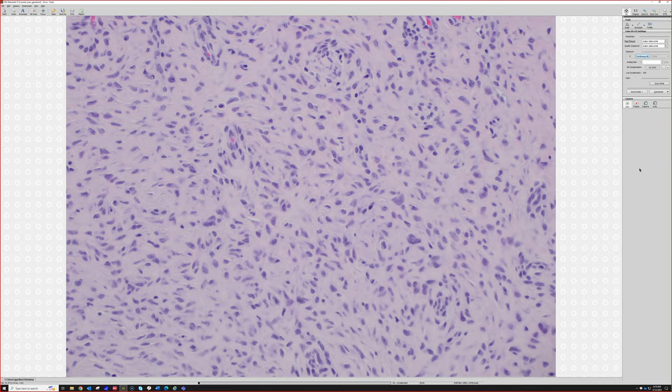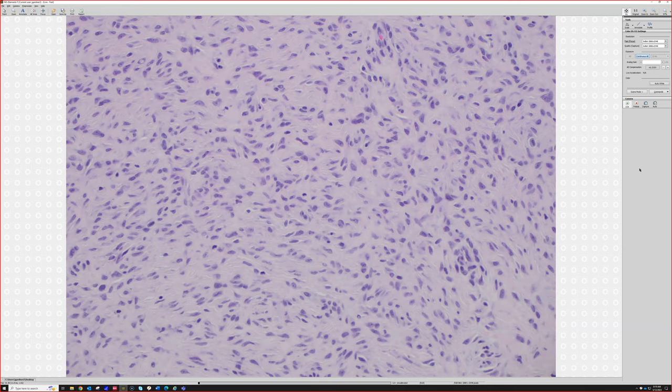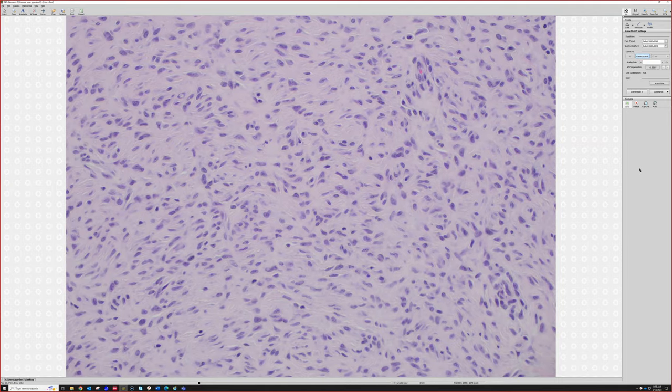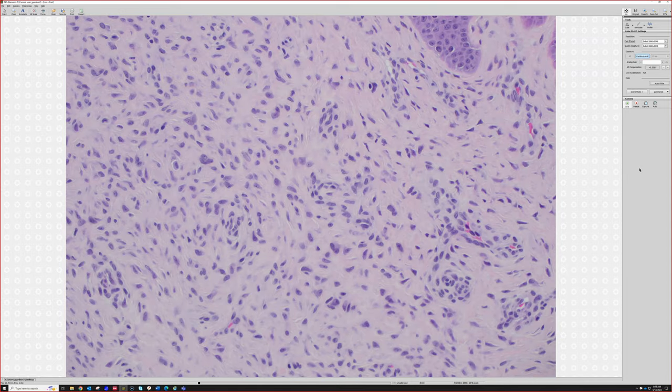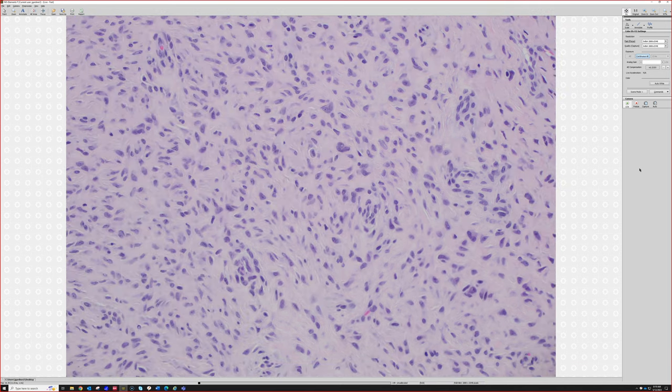But if you think it's a weird looking DF that's kind of got a collarette or kind of circumscribed or more plump cells, keep epithelioid FH in mind. It's totally benign. And so that's why it's kind of nice, because if it's kind of weird and you're like, I don't know what this is, and then you do the ALK and it's positive, and some of them are more epithelioid than this, and you might think of a melanocytic lesion, so you can do S100 or SOX10 to prove it's negative. And then the ALK is confirmatory.